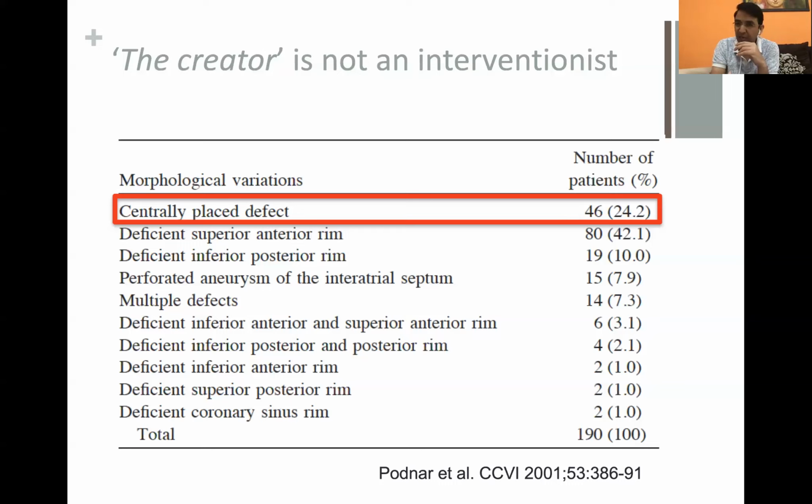There was an absent aortic rim, but we placed the same device in the next attempt. So this was prolapsing from the aortic region, which is not uncommon. Despite having the correct size of the device, it's mostly related to the orientation, the way the superior aspect of the LA disc is coming, and that is beautifully seen on TEE.